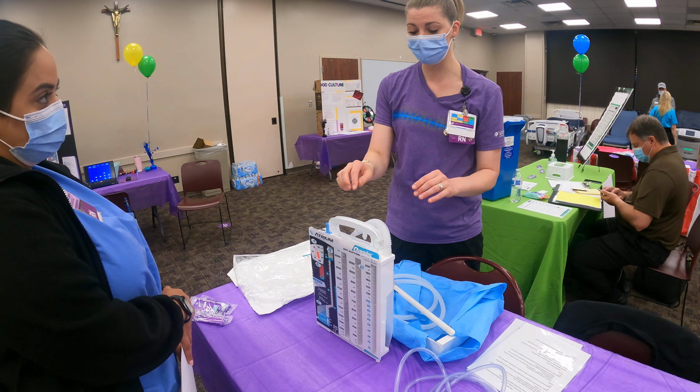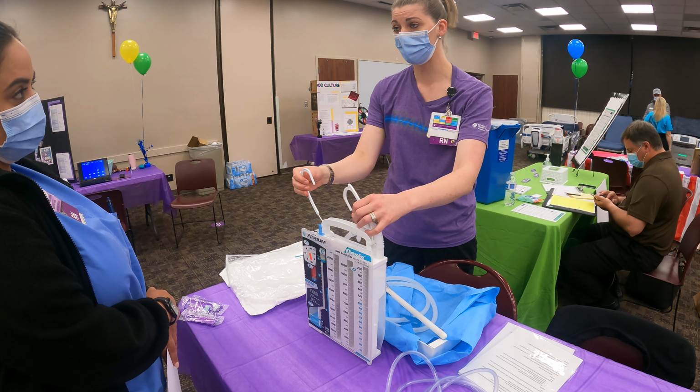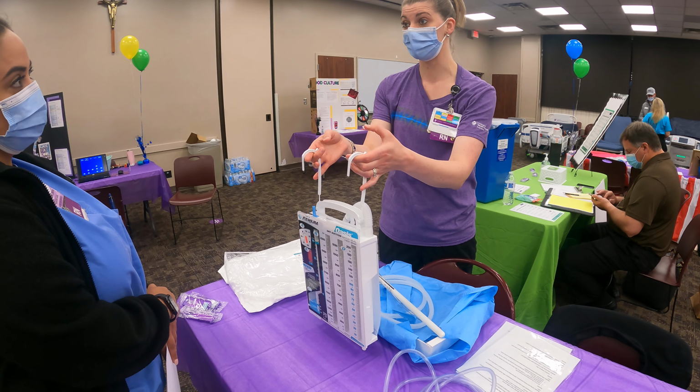Okay. If a patient is transporting, you have the handles that come out of the top that can hang on the side of the bed.